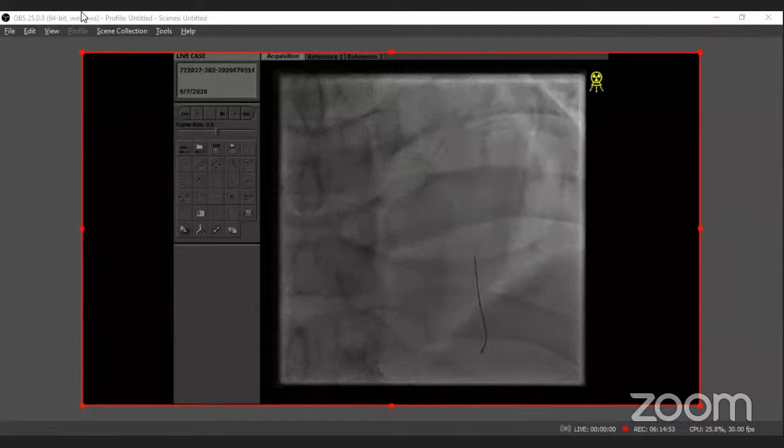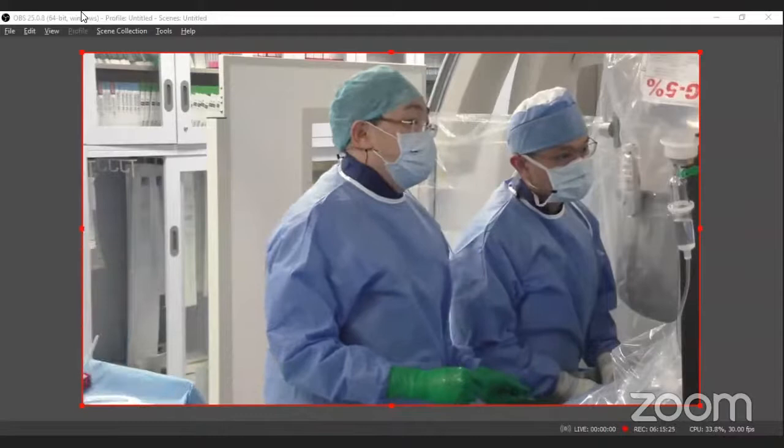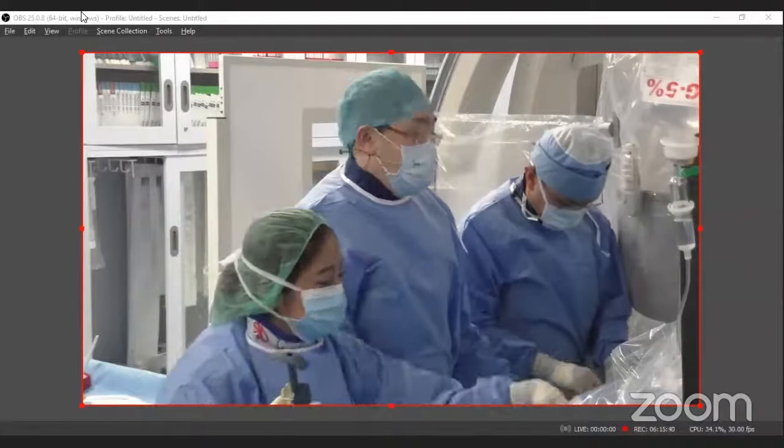Okay, like Rosalie mentioned, nowadays they give me the 3.0 by 28. I think it's Jimmy who mentioned double kiss culotte. The reason being, when we open up the stent struts on this side, the opposite end of the stent actually gets pulled inside. So when you rewire, it may go underneath the stent struts. But I think in these big vessels it's less likely. So in left main, I don't usually do a double kiss culotte. Maybe in smaller branches, I may consider to do double kiss.